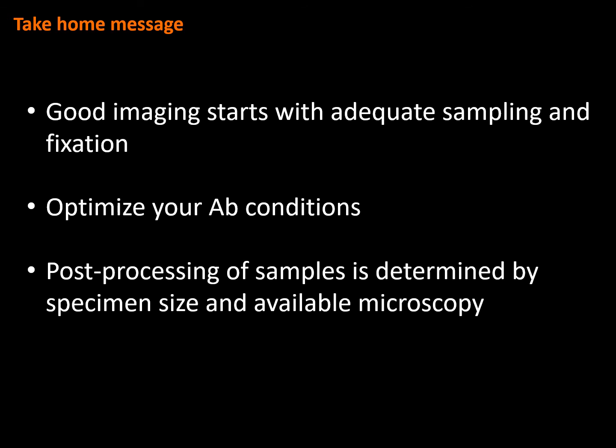Your sample dimensions might interact with the way by which your antibody detects your target, and post-processing of samples is determined by specimen size and available microscopy. So you also have to bear in mind that for you to have the best imaging possible, you have to have the most adequate embedding media possible.